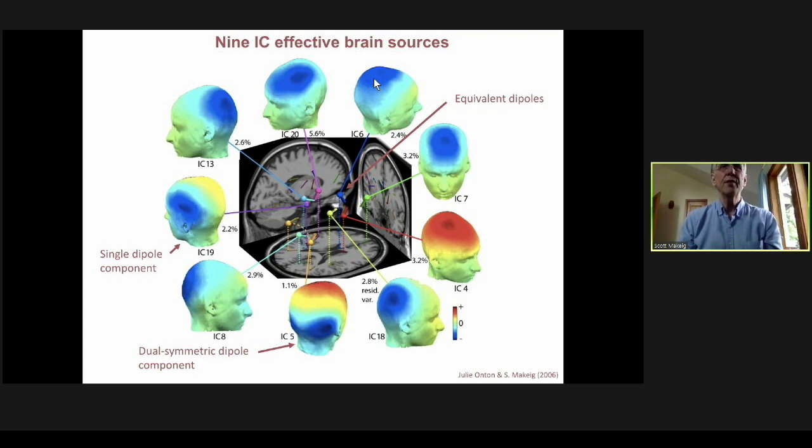Now, the beauty of using ICA, and why we persevered all these years, is that you change from these very messy spatial filters that are scalp channels into a set of very coherent, effective source processes, which you can localize and which have much higher signal to noise than channel recordings. So in fact, when we look at clinical data, the amount of information about individual subjects contained in the source components is much larger than in their mixture recorded as scalp channels.